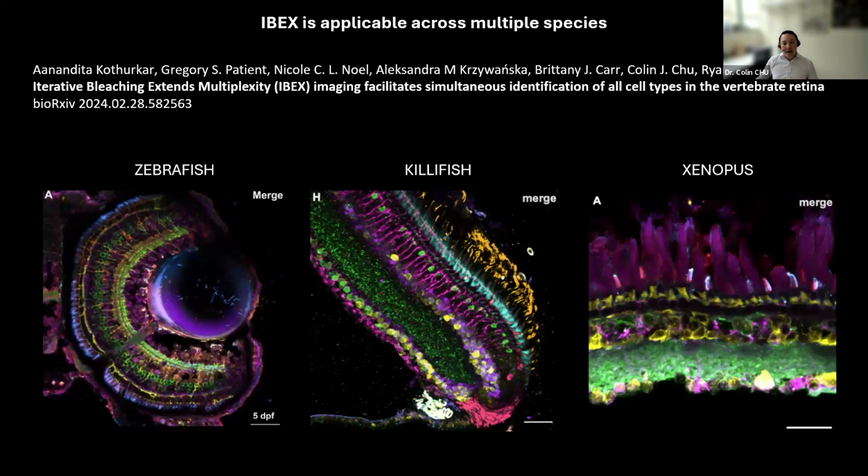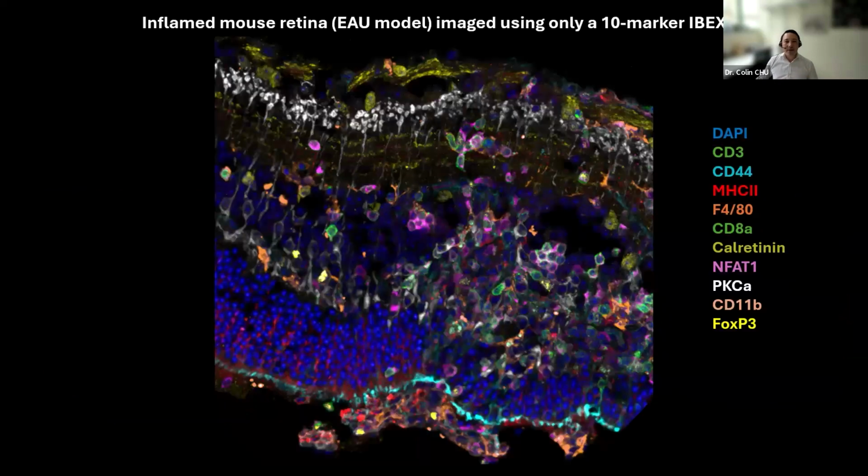in this system. Some commercial solutions with fancy oligo tagging can be quite difficult to adapt, or you may be tied into, for example, the commercially available ranges, which certainly if you work outside of the very popular, for example, cancer or immunology ranges, you may struggle to access. But for us, using these bespoke and rare markers that, for example, might only be in the eye that we need, we can repurpose and readily integrate these. So that's another advantage. And then this final image is of a mouse retina.